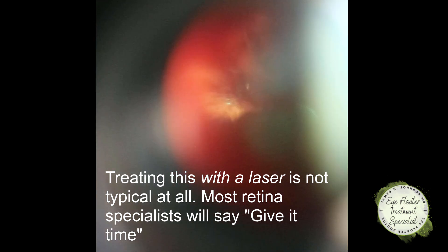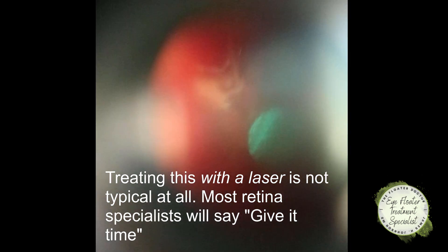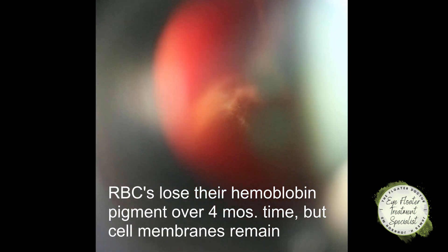This is not typical at all - I've tried it a couple times before. With the right light you can actually see - there's millions of red blood cells in there where they're aggregated together. I was trying to describe it to Paul - have you ever seen videos of starlings flying through the sky? That's what it kind of looked like with the lighting. There were dense aggregations and they kind of spin up; it has this very organic look to it.